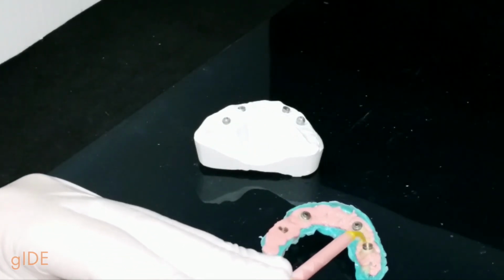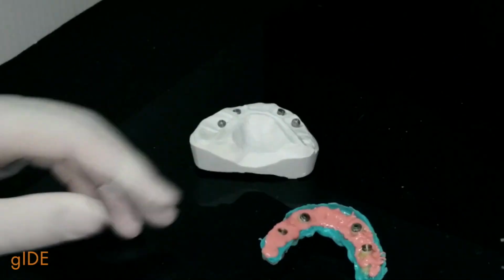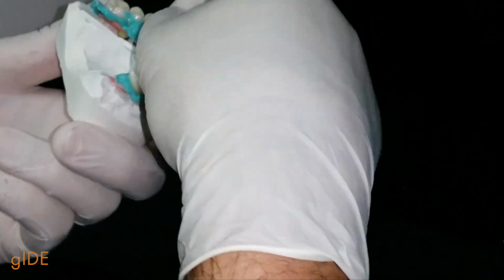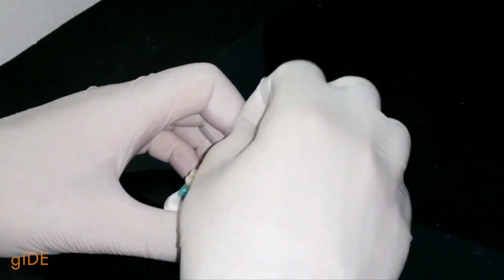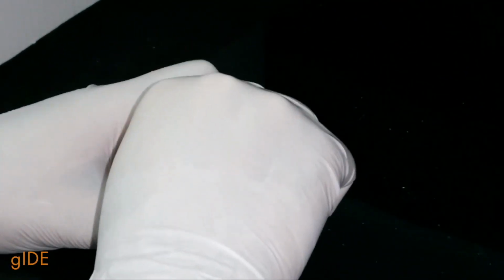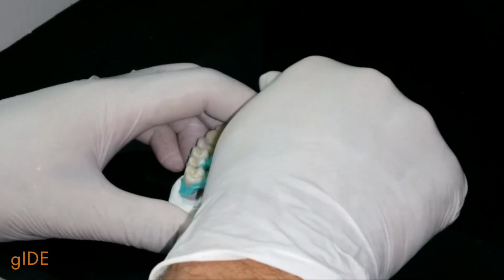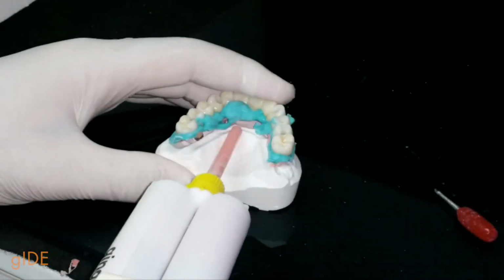So we can see how we put some pink silicone material for the soft tissue reconstruction on the temporary, and then we screw the temporary on the model. In that way, in the model where we were able to create a good 3D implant position thanks to the impression with the plaster, now we are able to create the ideal soft tissue morphology thanks to the impression taken with the temporary restoration and with some silicone material that we normally use for our impressions in tissue-supported rehabilitation or for implants.